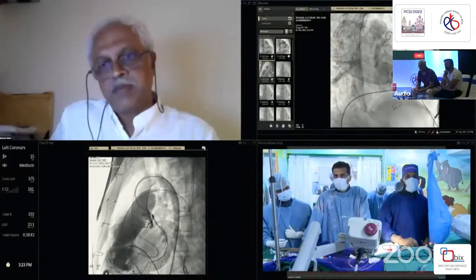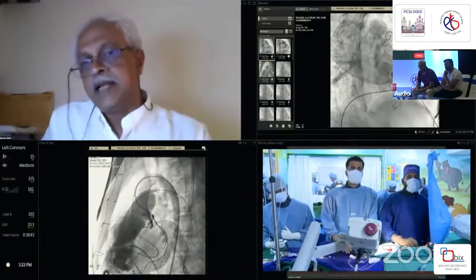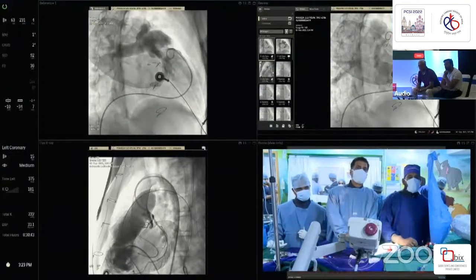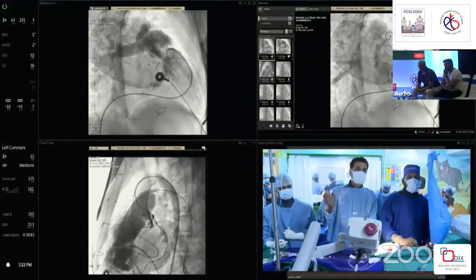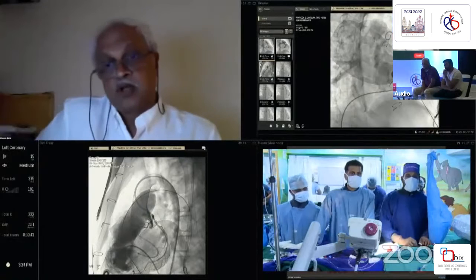I agree with you that there is no seepage, but Dr. Bharat, are you telling me, Muthu, that with this pacing, that RVOT is really pulsatile? No, I agree with your point, Dr. Bharat, but again, it is all collaborative. Absolutely, your point is well taken. We are collaborating the findings from the CT and looking at the waist, as well as in addition to that, we use this. I would like to have other people's opinion on this.